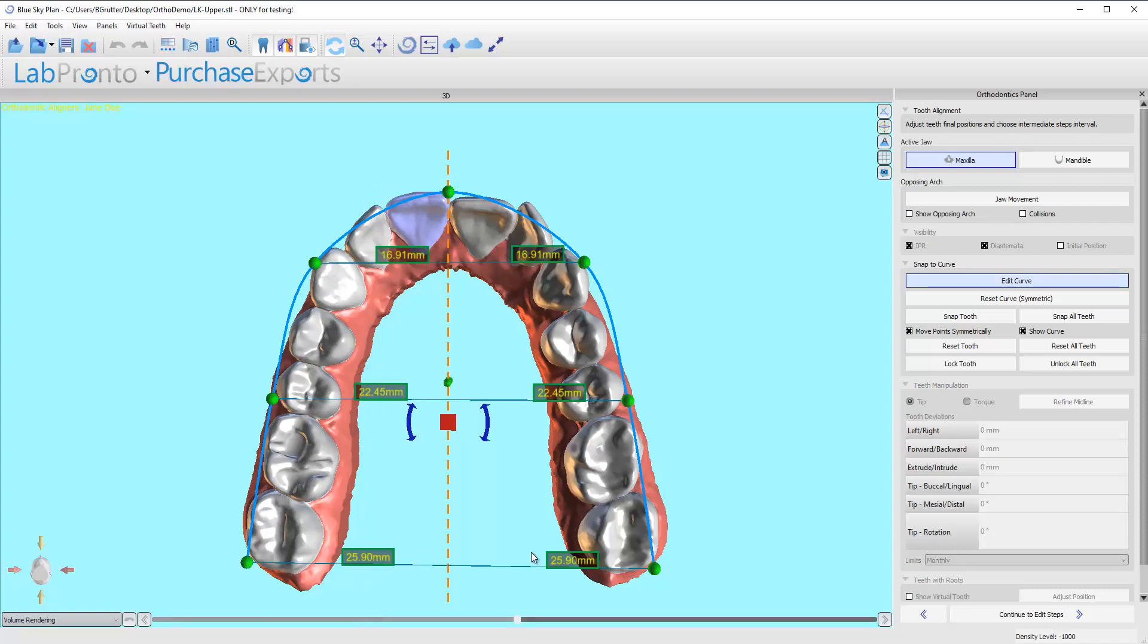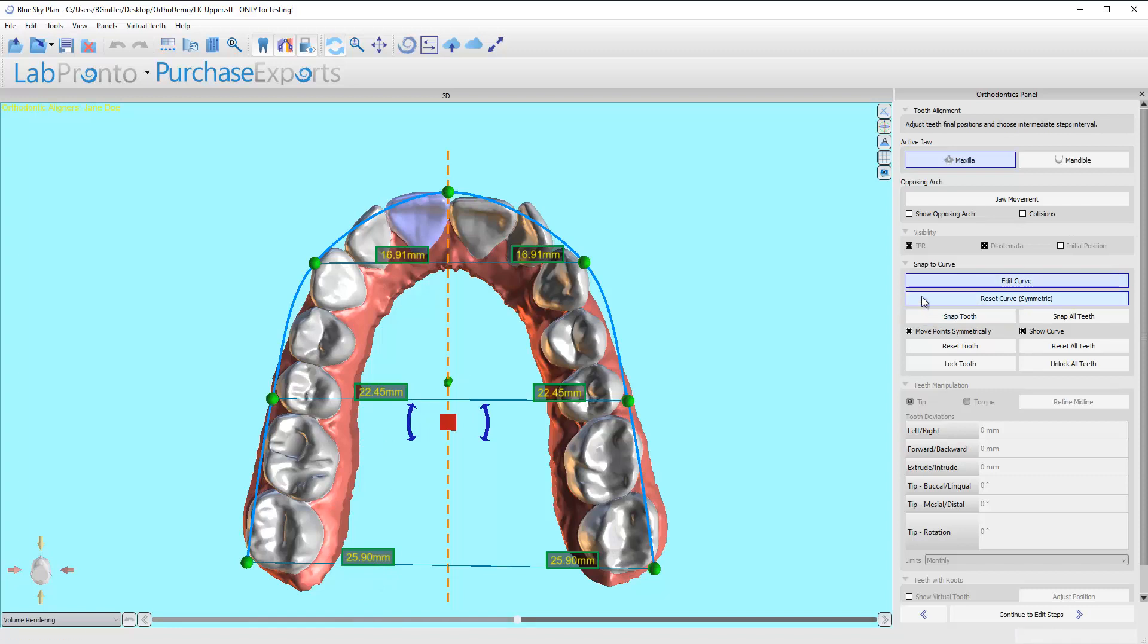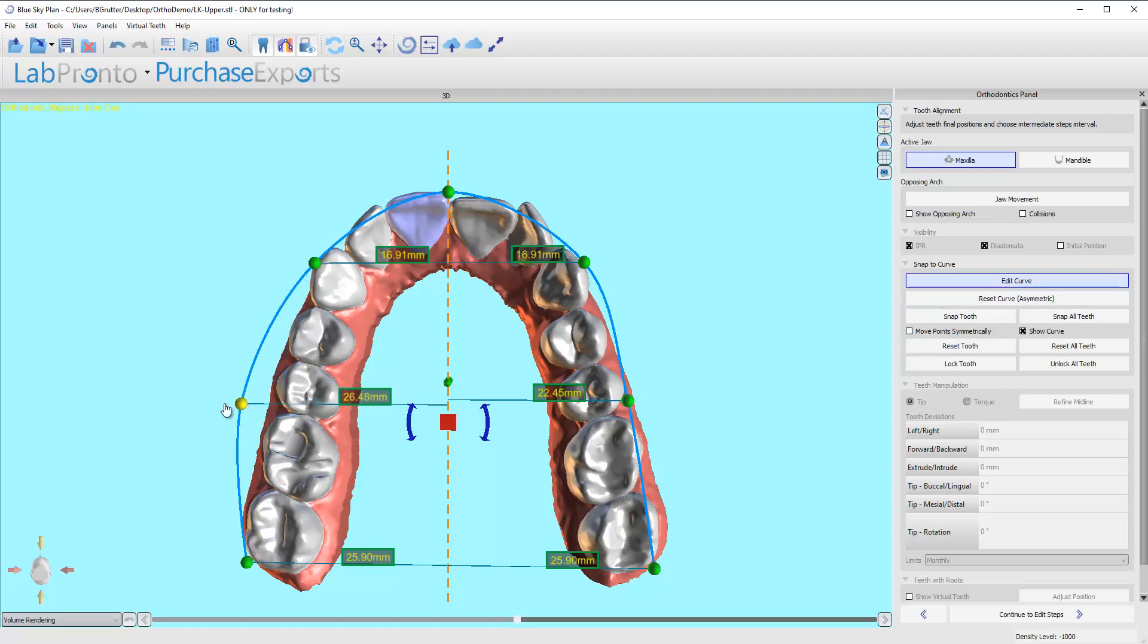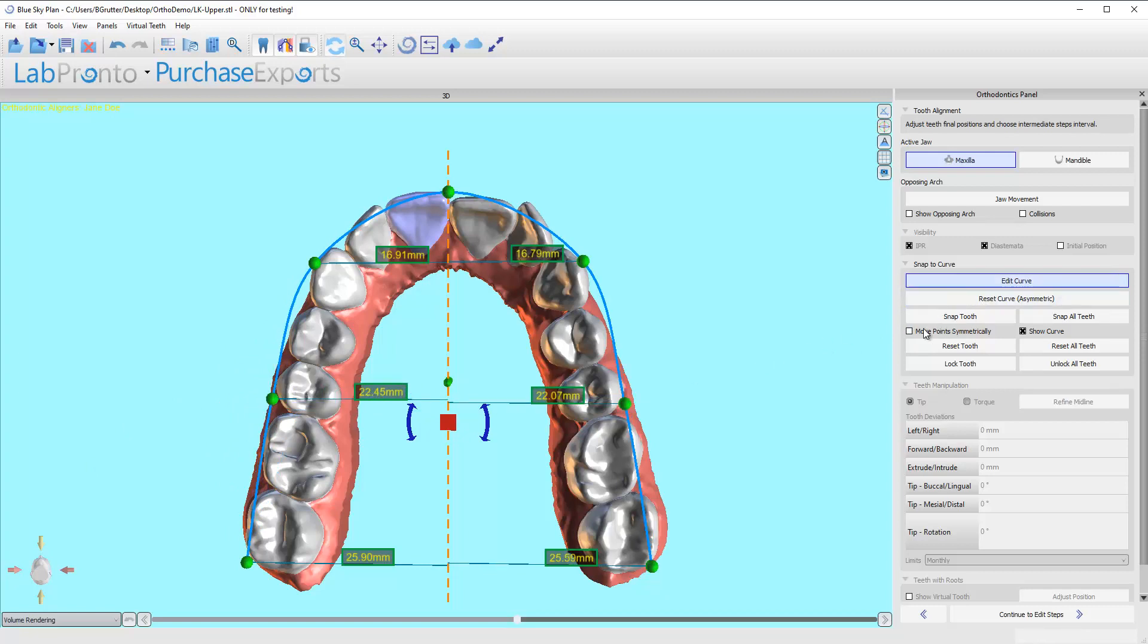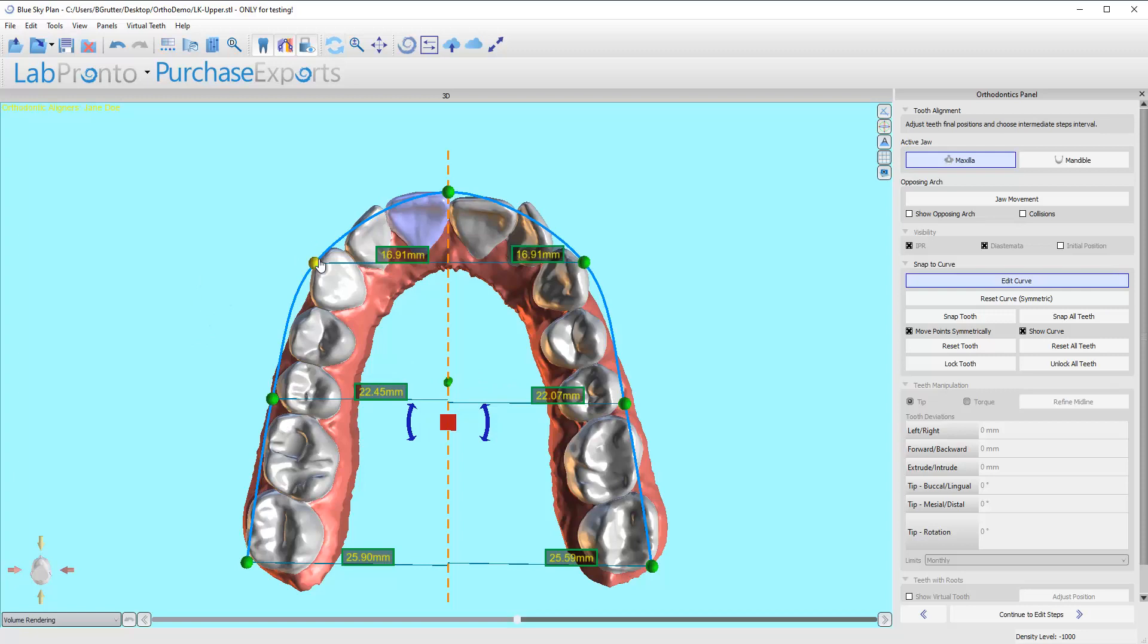If you want to change things so it's not symmetric, we can go ahead and click this box and I can move things however I want, and then I can reset it to symmetric. I want most of the time to have a nice symmetric final outcome.